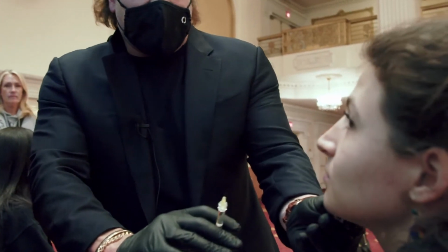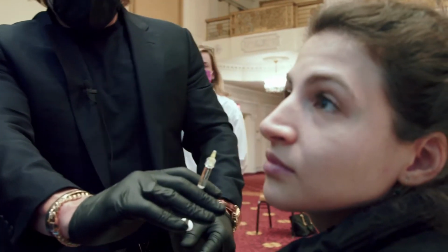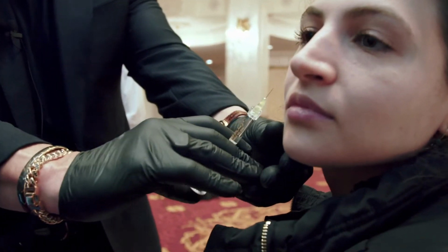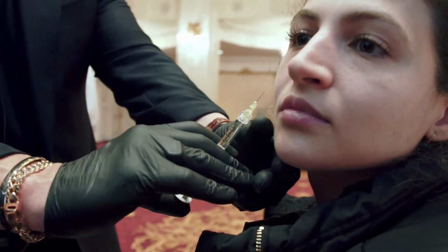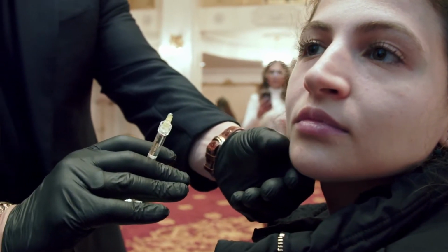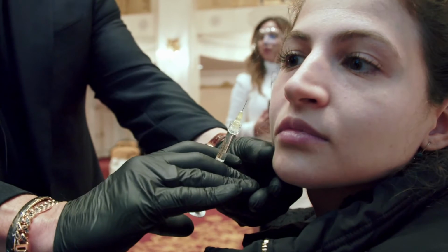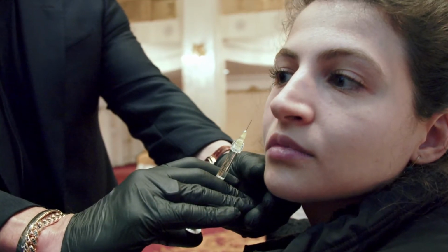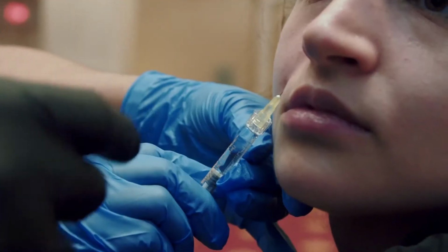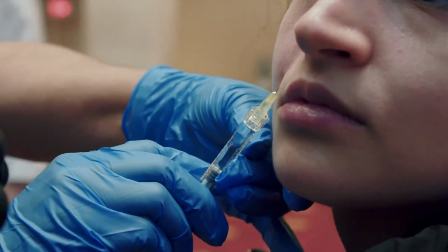Let me, can I turn your face? If you go in just like this, look at that. That's the correct depth. You don't even have to do anything special. You're right there. And now you have your hand here, okay? And then with this thumb, you pull taut on the skin and rest your hand right there. You're all set up. You could do it so easily. So there we go. Try to do it like that. Yeah, that's good. Good pressure.